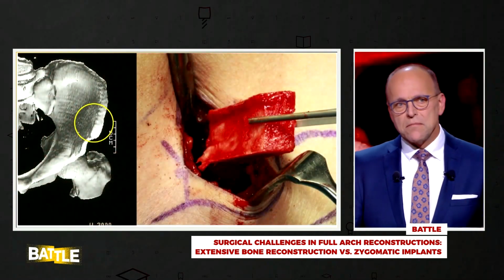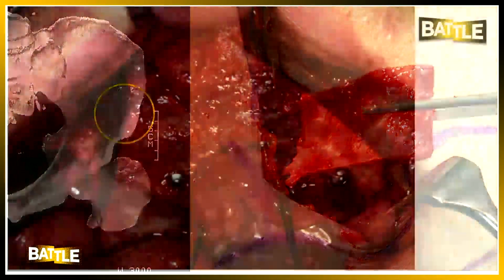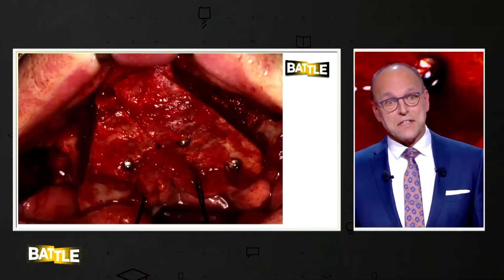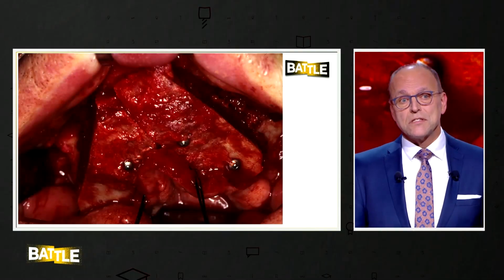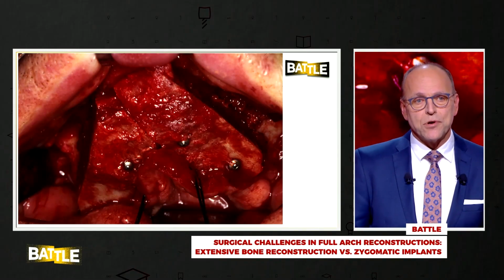One of the most commonly used extraoral sites is the anterior part of the hip, right? Yes, that's what we're looking for, the iliac crest, and you see these bone grafts that we can procure have adequate volume. They are corticocancellous bone grafts, and when you fix them to the jaw, you can see that they can adequately restore the ridge of this severely resorbed maxilla. The downside of this approach is that these procedures are so extensive that we have to take the patients to hospital, which increases their treatment burden considerably.